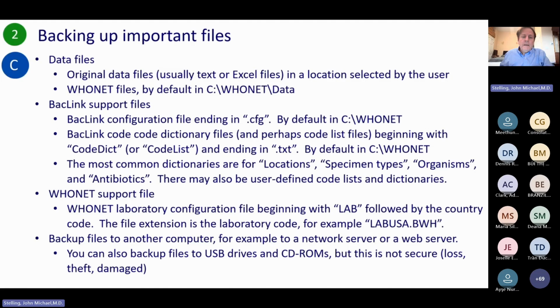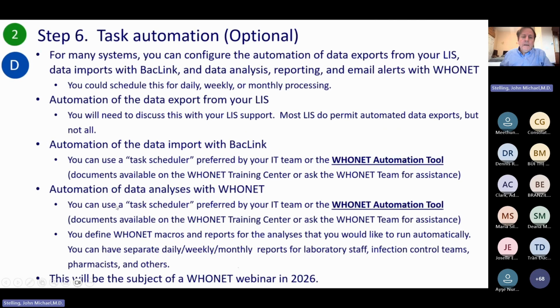Okay, little comments about automation. This will be the subject of a future webinar. You can schedule automated weekly, monthly, daily, using the automation tool. We can automate BacLink and WHONET in email notifications.